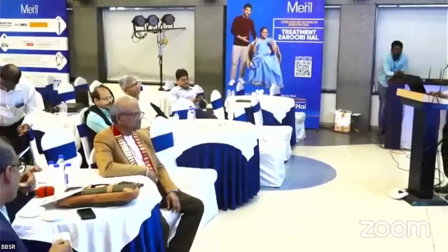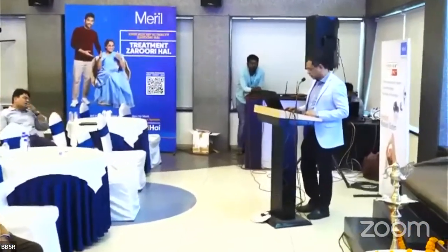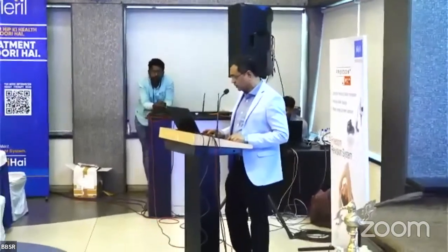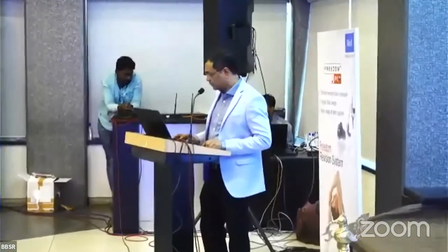Bone defect more commonly occurs on the tibial side. In case of varus deformity, it is usually posteromedial, whereas in valgus deformity, it is usually posterolateral. Several options are available in your hand when you are reconstructing bone defect. You need to identify them preoperatively with the help of orthogonal X-ray. If the defect size is small, you can increase the thickness of tibial cut, or you can reconstruct them with the help of cement augmented with screw, or you can use bone graft or metal augment.